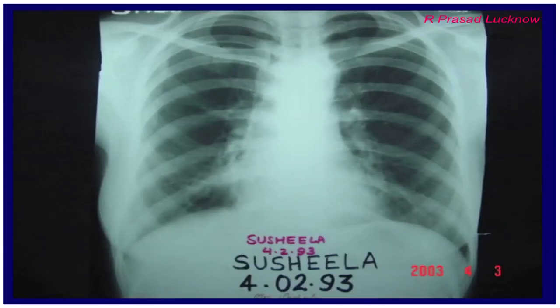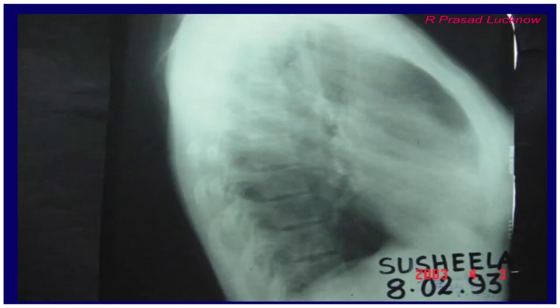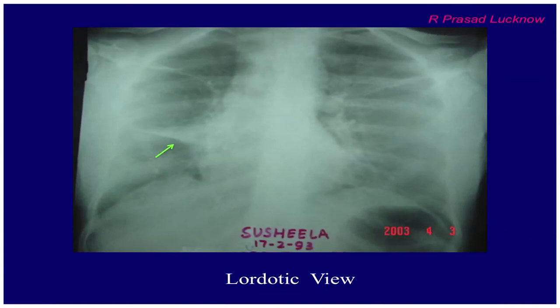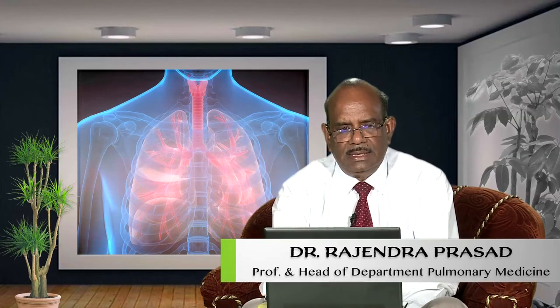Again, a lady came to me in 1993 with recurrent hemoptysis. If you see the X-ray carefully it looks normal, and the lateral view gave no information — even the lateral view appears normal. When I did the lordotic view, you can see the clavicle has gone out of the field and there is a triangular shadow in the paracardiac area — the textbook picture of middle lobe collapse. As I said in my first lecture, middle lobe collapse may not be visible in chest X-ray PA view or even lateral view, but it can be visible in the lordotic view, and of course in CT scan.